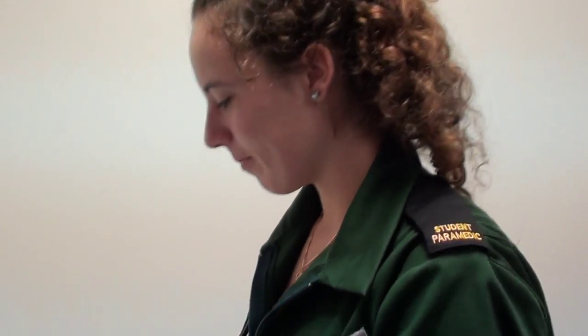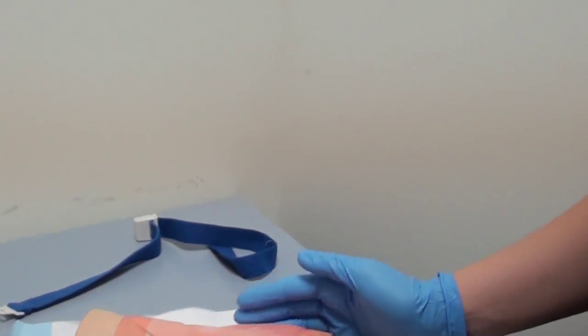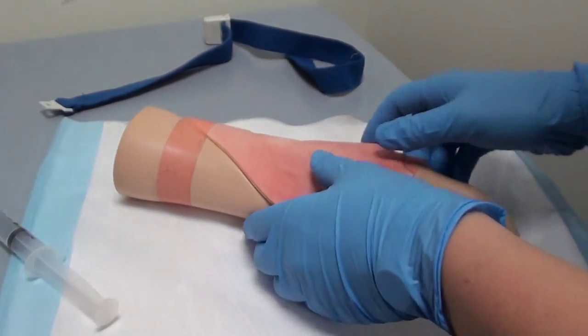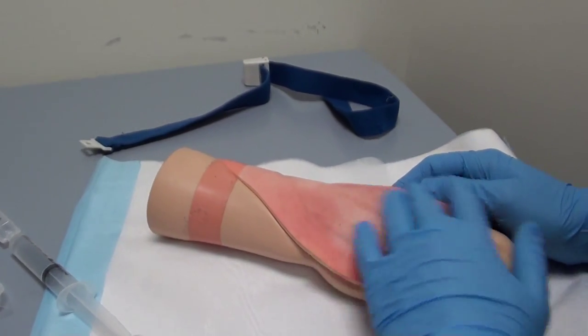Hi, my name is Ruth and I'm just going to demonstrate the skill of inserting a cannula into a vein. So this is my patient's hand. Just having a look to see an appropriate vein. So I might go for that one.